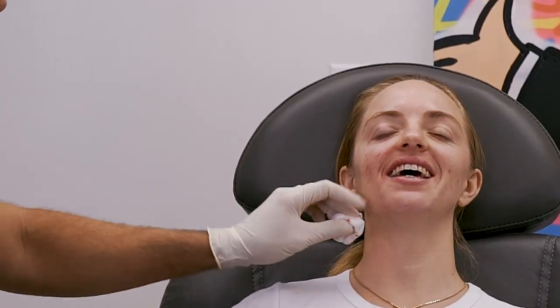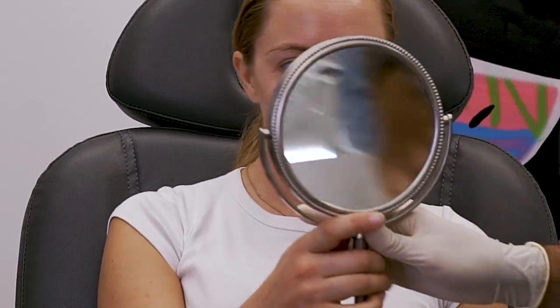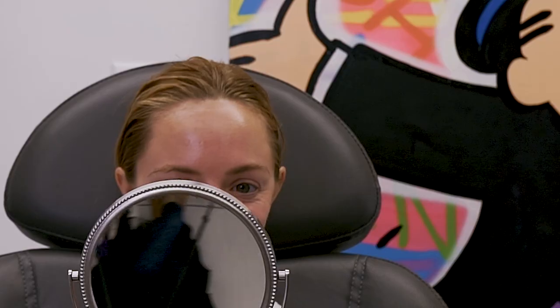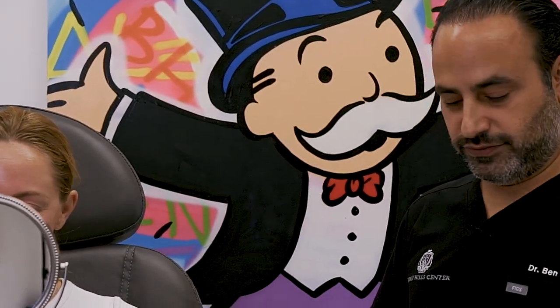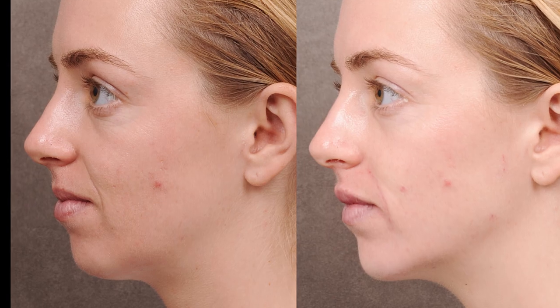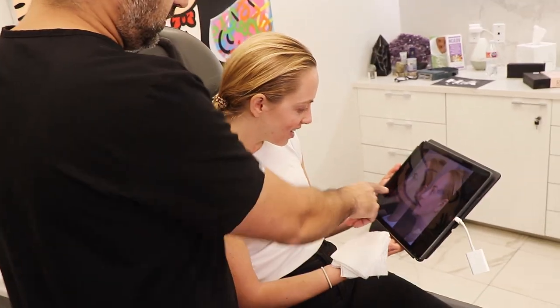All of that is done. You now just have the tiniest bruise on that lip, but otherwise finito. See — just healthier. The chin and the jawline — I didn't go make a different chin, I kept her chin, I just enhanced it a tiny bit. People go way too far with that stuff. From the front, creases just aren't as deep. There were no folds to really fill. You can see the mouth — lower lip had that little sulcus, now it's hydrated. Upper lip was buried with skin hooding over on both sides, now it's folded up. Go enjoy your face now.